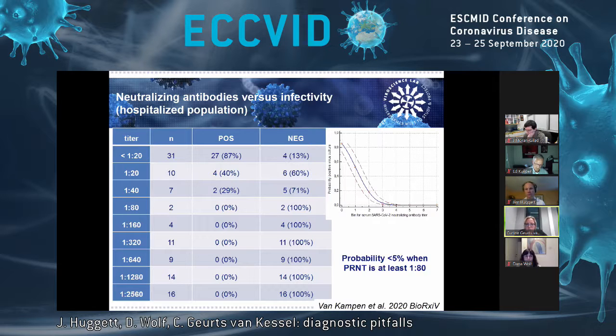Of course, again, when using this kind of neutralization assay, you would need some standardization, and currently we are working with standardized sera to test and to see if we can quantify this better. But it's just an example of how we have added these serology parameters to the diagnostic workup in our center, to define if we think that a patient is still infectious, yes or no, despite the PCR, which remains positive for a very long time.